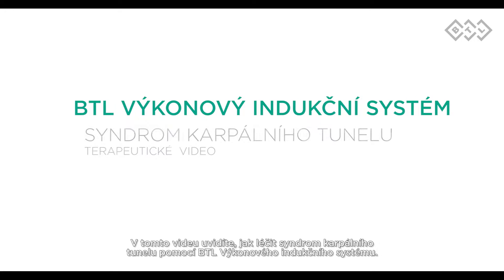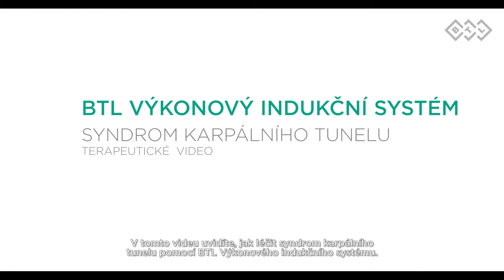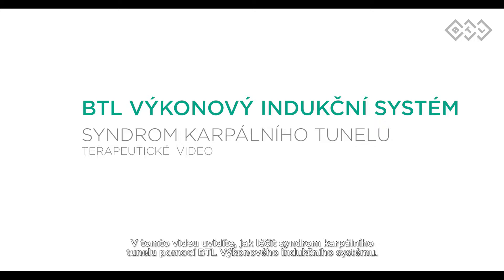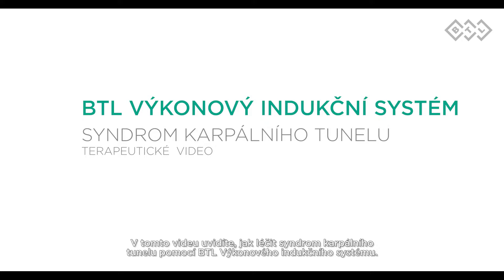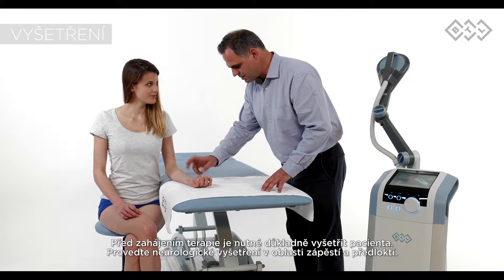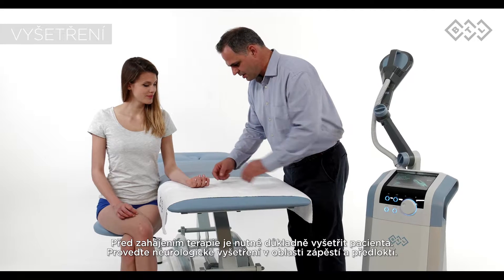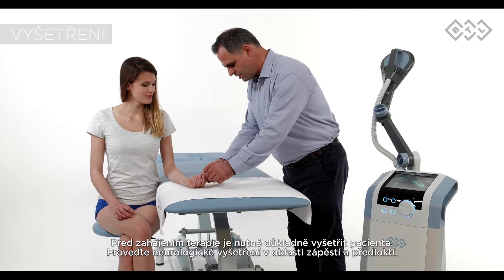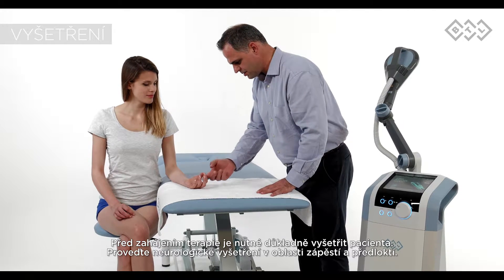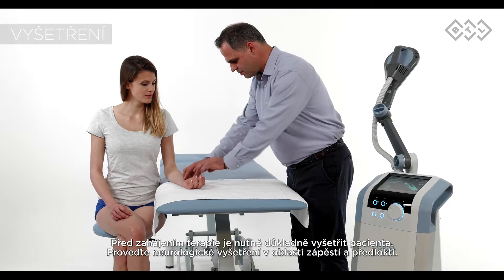This video will demonstrate how to decrease pain in carpal tunnel syndrome using the BTL superinductive system. Prior to the therapy, a thorough examination is necessary. Perform neurological tests of the wrist and the forearm to define the disorder.